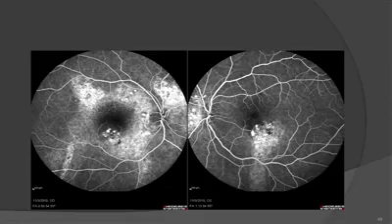The second way is to put the laser first in continuous wave mode, and you fire at the periphery of the retina. Once you find the blanching effect, you triple the power. For example, if you find the blanching effect at power 50, you put it at 150.